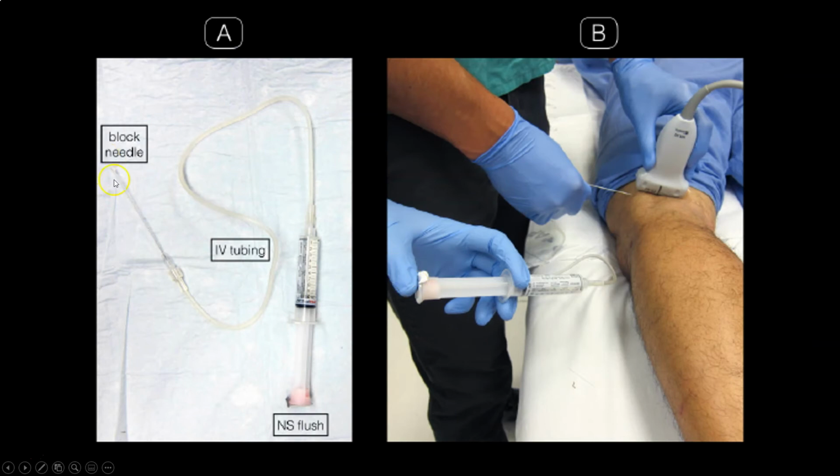So a block, there's a few different ways of doing it. You use a syringe here, with either a length of IV tubing, or we typically do to jury rig it as we use a couple of IV connectors. And then you can use a block needle, which we usually use a spinal needle instead of that because it still shows up on ultrasound reasonably well. And then this is a 2-operator technique where the first operator is holding the probe in their non-dominant hand and their needle in their dominant hand.